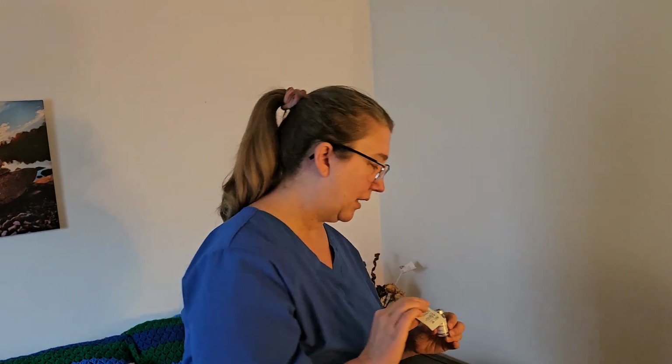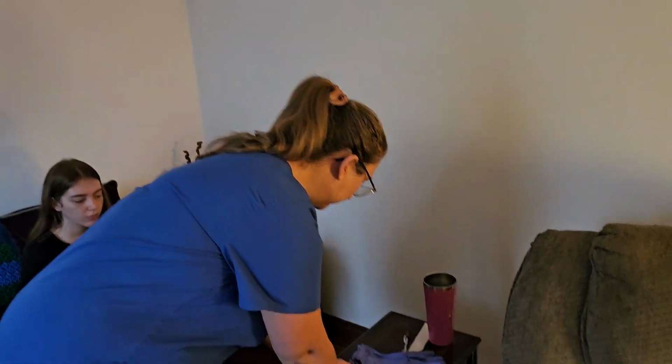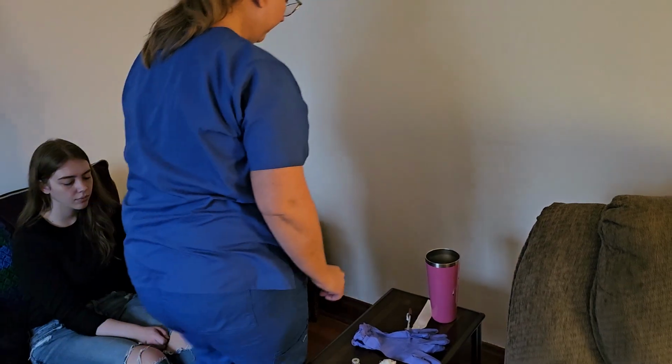I'm not going to wave it. I'm not going to blow on it. I'm going to let it dry naturally. That way it doesn't get contaminated again. And I'm going to set it here to the side. Let that dry. Now, I'm going to grab the appropriate syringe.